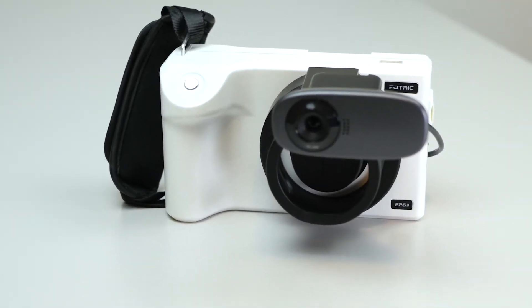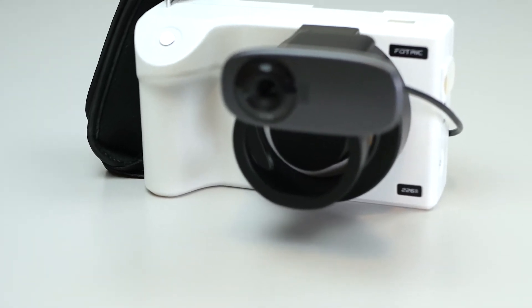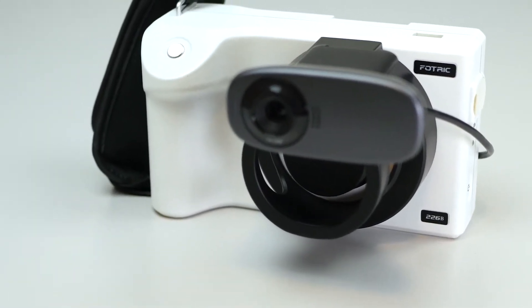In this video, we'll take a look at some common mistakes to avoid when setting up the FOTRIC 226B temperature screening system.